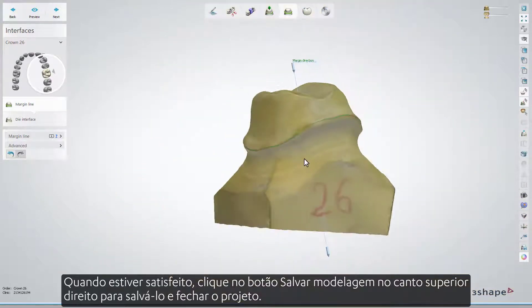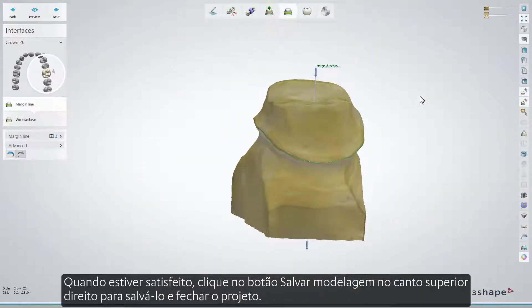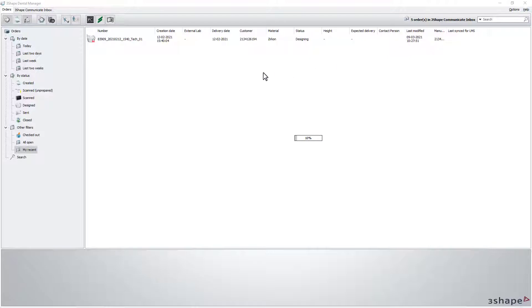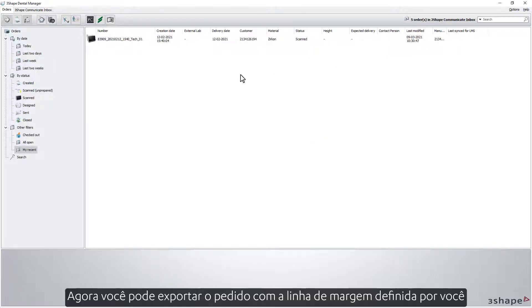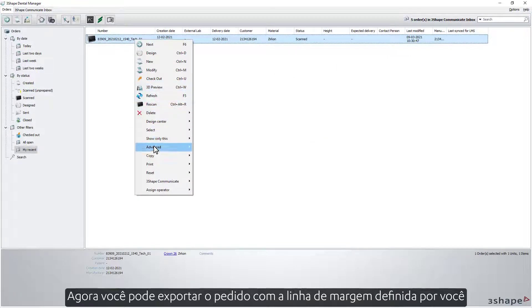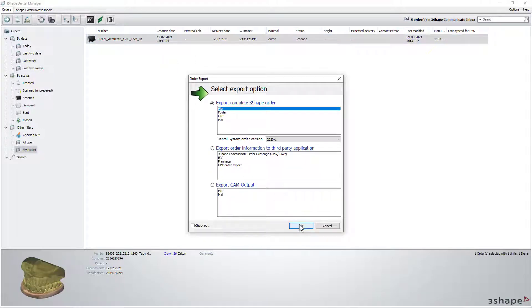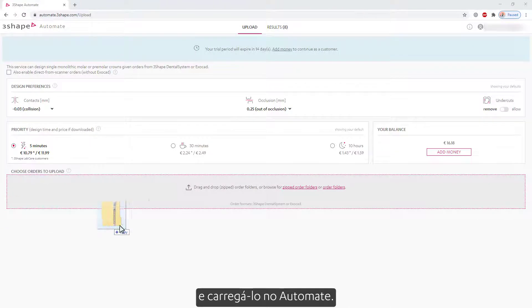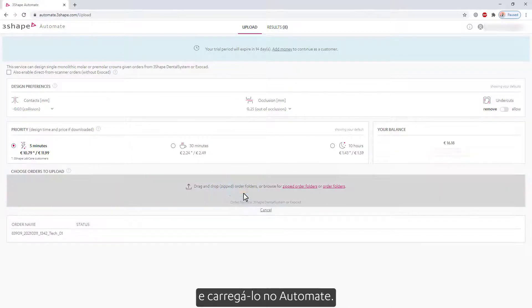When you are satisfied, click the Save Modeling button in the upper right corner to save it, and then close the order. Now you are able to export the order with the margin line set by you, and upload it into Automate.